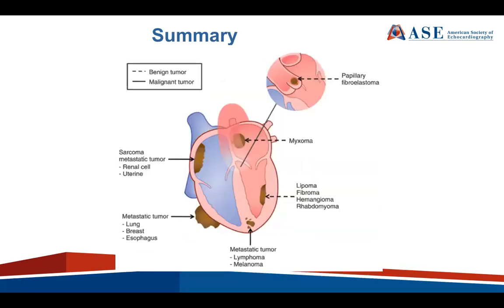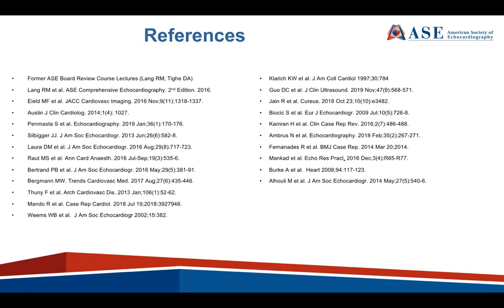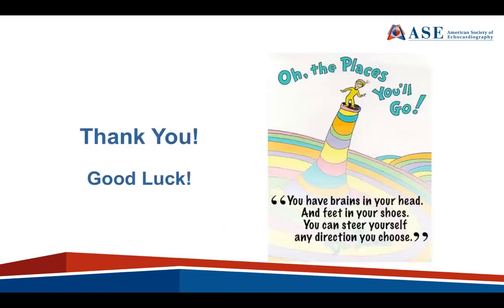And this is another way that we're showing that schematic with some more detailed information about tumors, either benign or malignant, in various chambers of the heart. So pay attention to this, recognize this as well. Here are the references in case you're interested in going back and looking at some of the primary documents and literature regarding this. And then as always, good luck with your test.